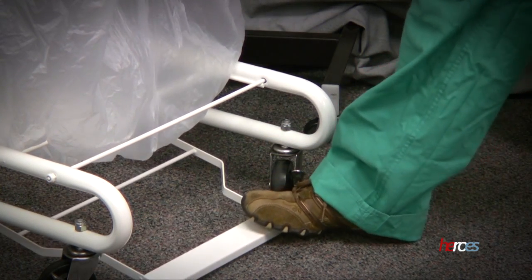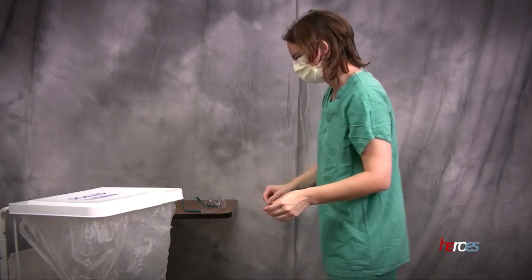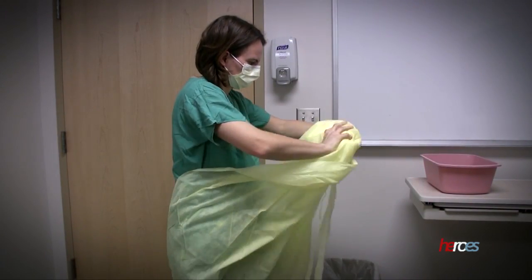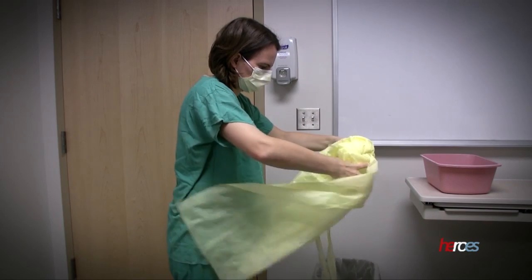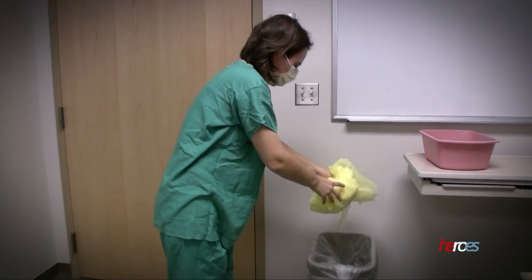Use the foot pedal to lift the lid on a linen hamper, then place the entire gown inside the bag. Disposable gowns may be discarded in the trash. Be sure that the entire gown is inside the trash can, as gowns left hanging are a risk for contamination.